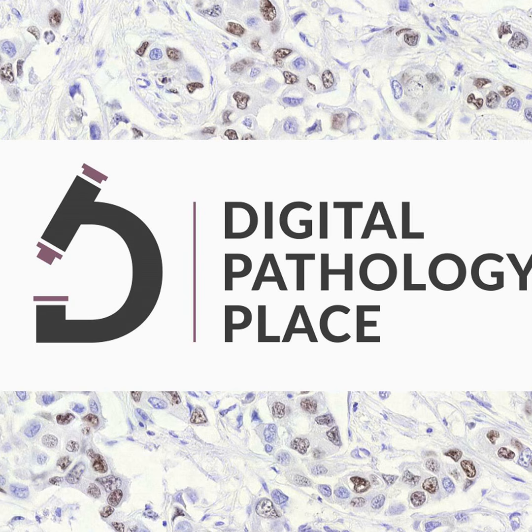So specifically for cervical screening, there is already a workflow that has a triage built in, and there is a cytotechnologist looking at it, and then the pathologist for the ones that are suspicious. And now you can put AI on top of that and do 100% quality control of the negative samples and catch anything that actually was not negative, was false negative, right? And if we could achieve total workflow automation, that would be amazing as well.